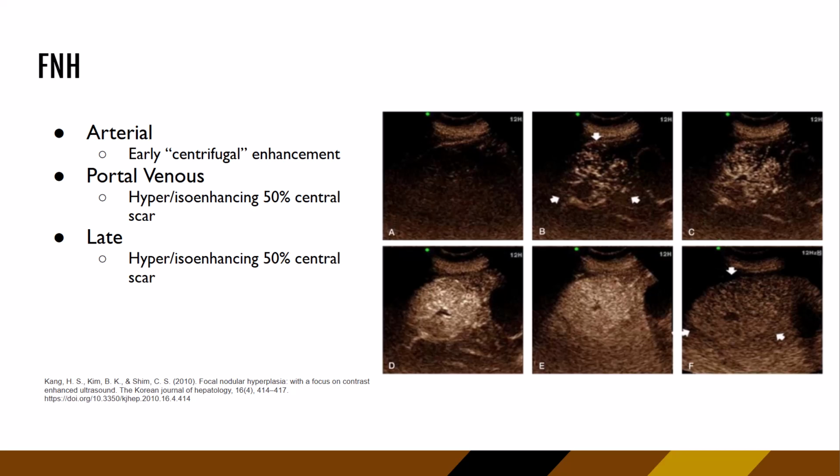So in this case, we're going to start with our pre-contrast phase. This is what we're seeing here. We don't see a lesion. On grayscale, we were probably like, maybe something's there, I can't really tell. Well, that's where contrast comes in really helpful. So we're in the area that we think we want to be in. We can't really see anything, but again, this is pre-contrast. Contrast gets put in, and we go through the arterial phases in our images B, C, and D. Again, we're seeing a pattern of how the contrast is flowing into the lesion through the blood vessels.